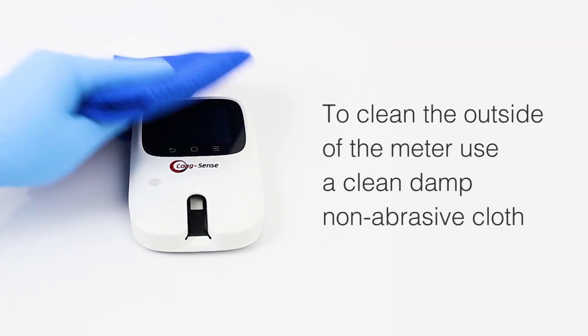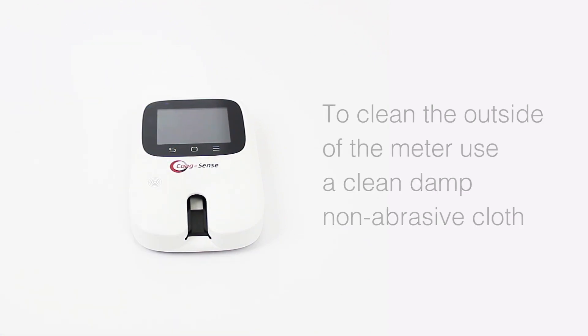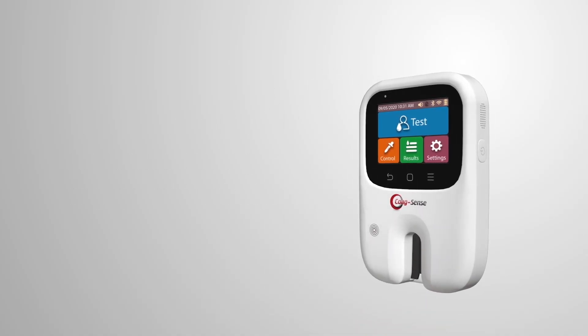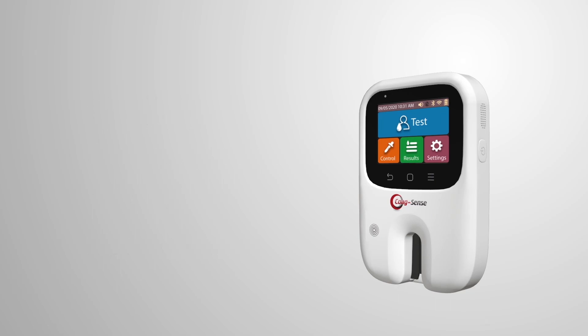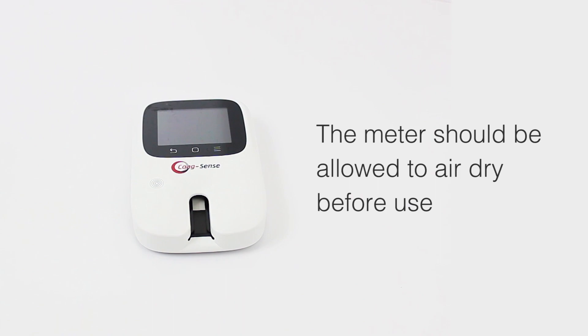To clean the outside of the meter, use a clean, damp, non-abrasive cloth. The meter can be disinfected using any germicidal wipes that have 0.55% sodium hypochlorite or 10% bleach solution with a 1-minute contact time. The meter should be allowed to air dry before use.